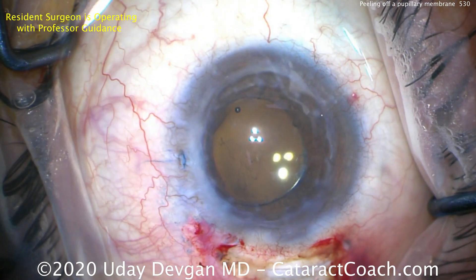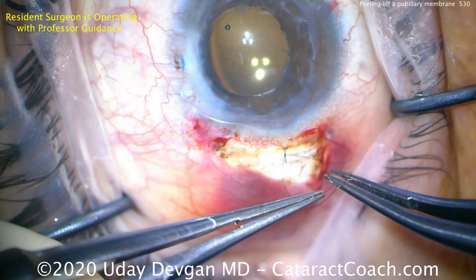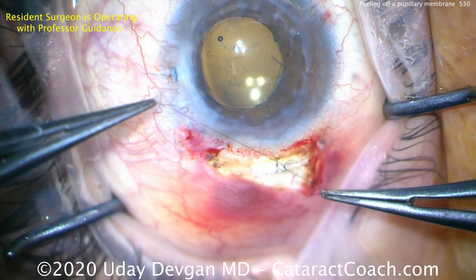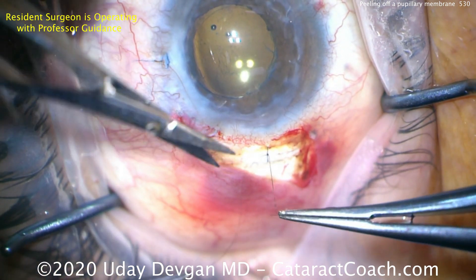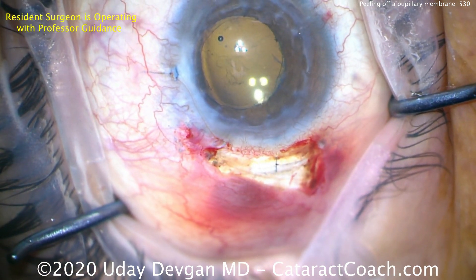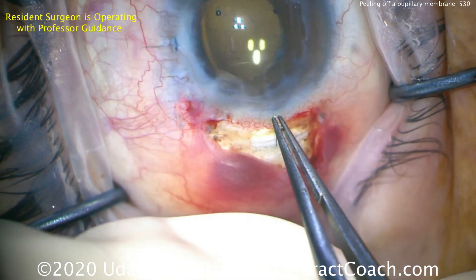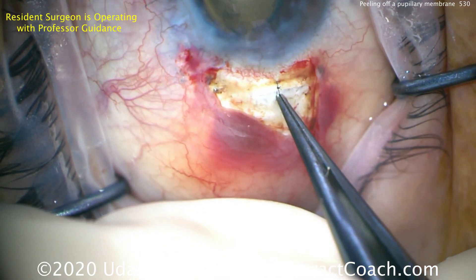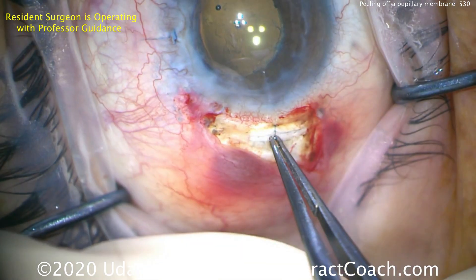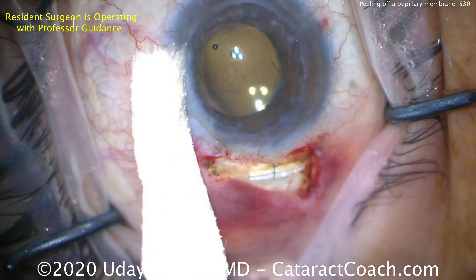That way the patient, if anything, will end up on the slightly myopic side. Removing the viscoelastic and cleaning up the end of the case — there's a nice overlap of that optic, which looks fantastic. In an eye like this I definitely suggest placing a suture, so here's a 10-0 nylon suture being used to close the main incision. This is a relatively easy procedure to suture, well within the wheelhouse of resident surgeons. Then we close the conjunctiva on top, rotating the suture knot into the cornea so it's totally buried in the sclera.